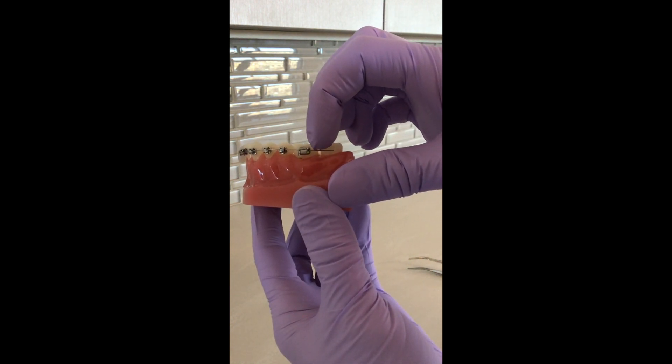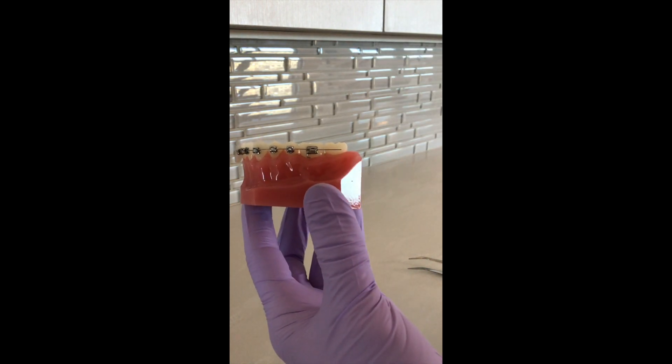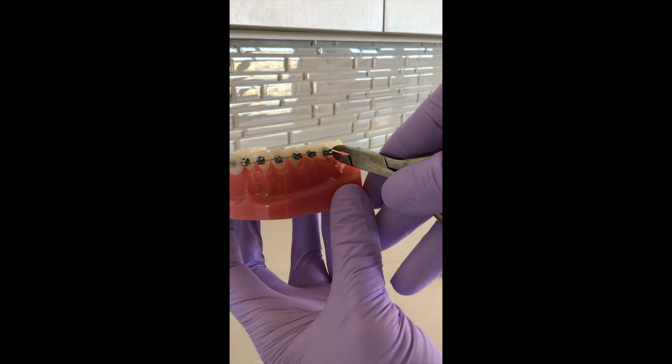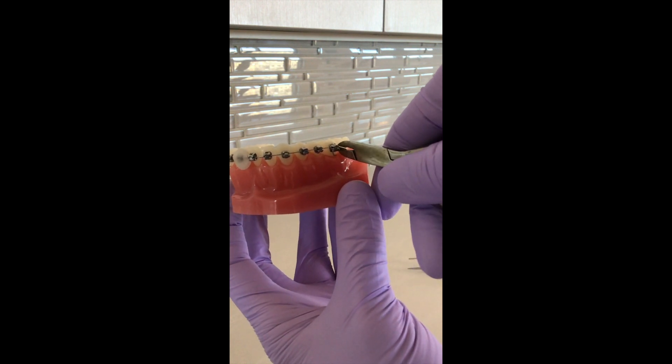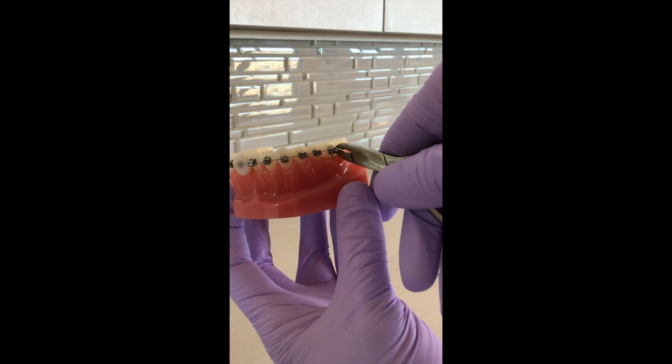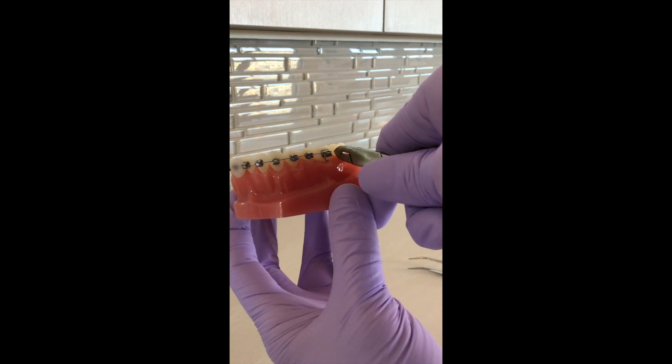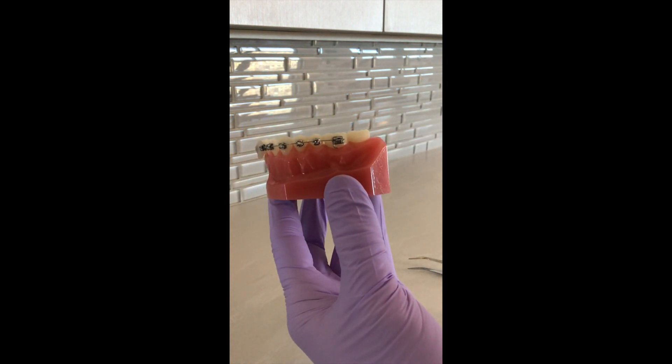whole wire off, just enough to keep you comfortable. Use your nail trimmers to get in there and trim as much as you can. This may require two people trying to pull cheeks out of the way, but you can get in there and just trim that wire, no problem. Just like that, and get rid of that wire.